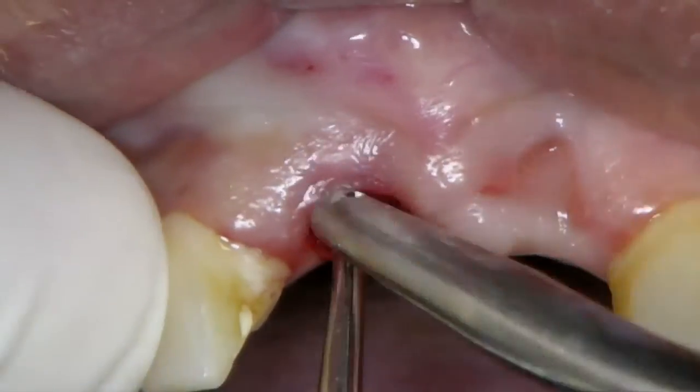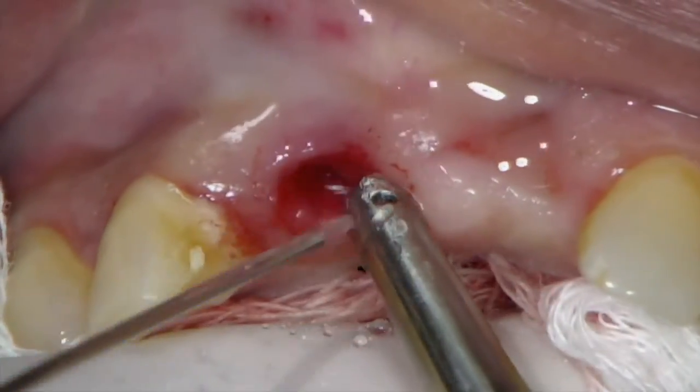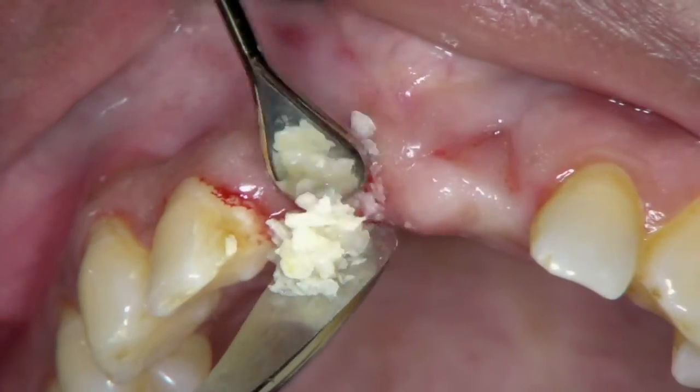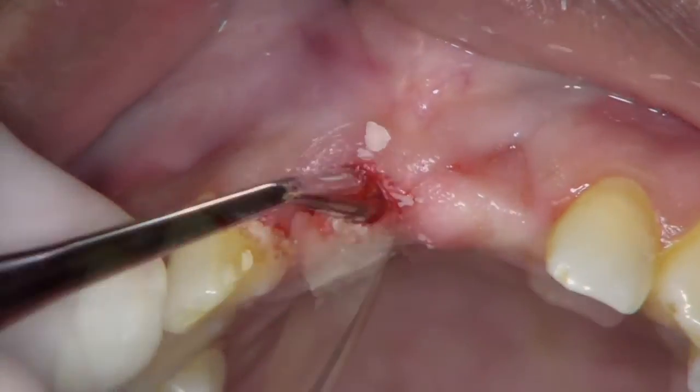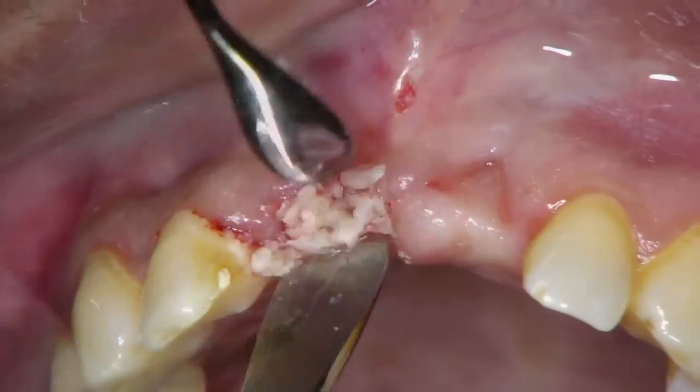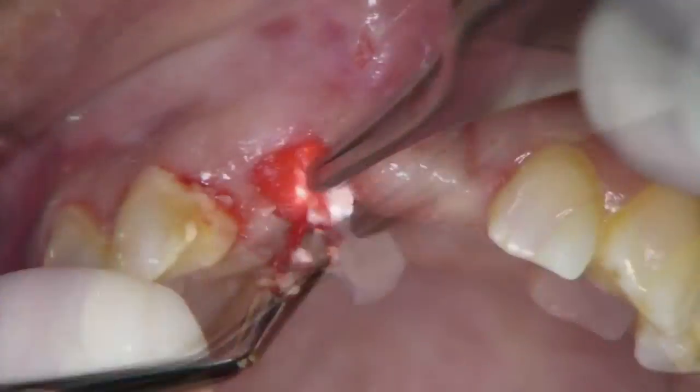The site is then gently cleaned and irrigated. We then place a small amount of bone graft material as a way to preserve the ridge, since the patient wants replacement of this implant and tooth in a few months.